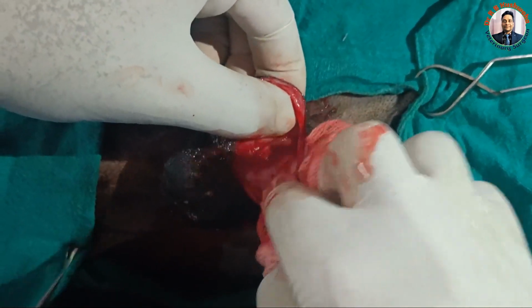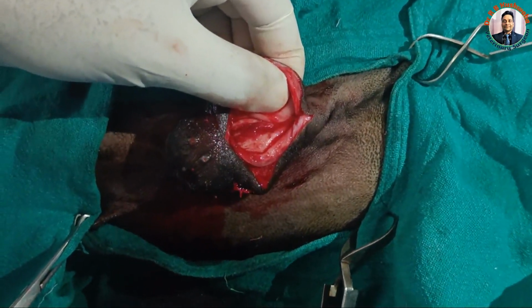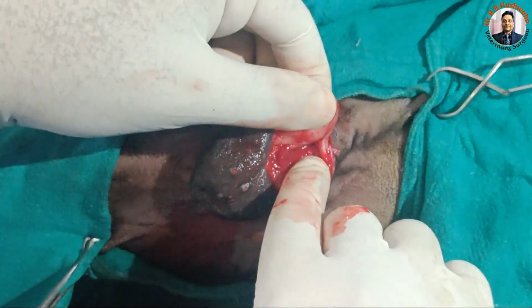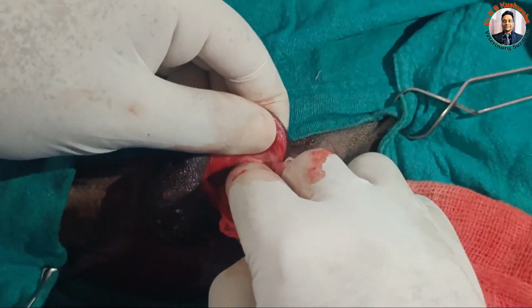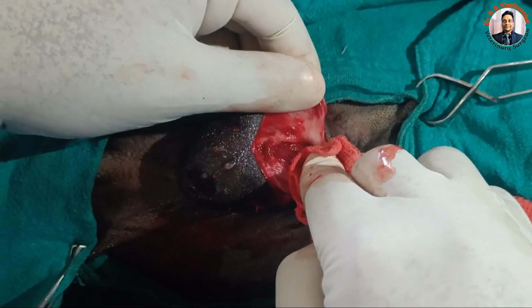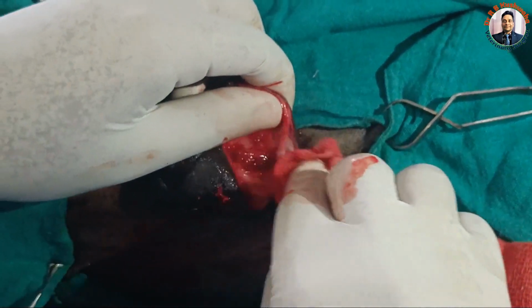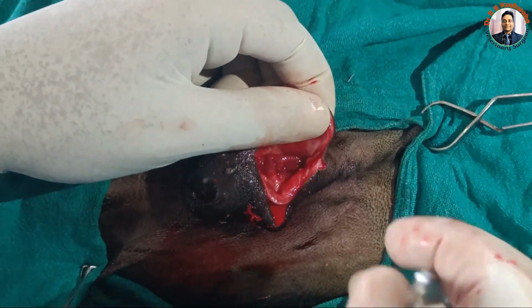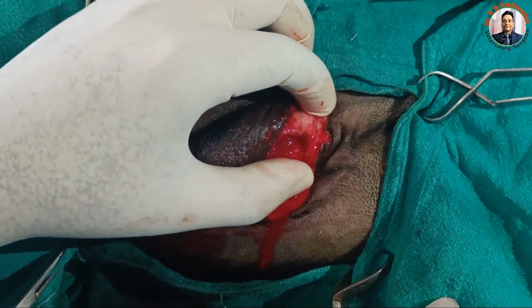Correcting a congenital anomaly is very difficult because even the normal structure you will not find. Give the catheter, eight number or 10 number. So now you could see this one is the urethral lumen, from where the urine is coming.